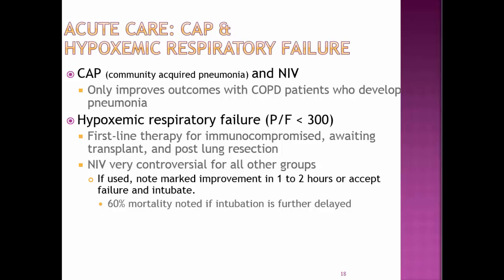NIV is only shown to improve the outcomes in patients with COPD who develop pneumonia. Hypoxemic respiratory failure, or a PF ratio less than 300. This is the first line of therapy for the immunocompromised awaiting transplant and post-lung resection. Non-invasive is very controversial in all other groups.